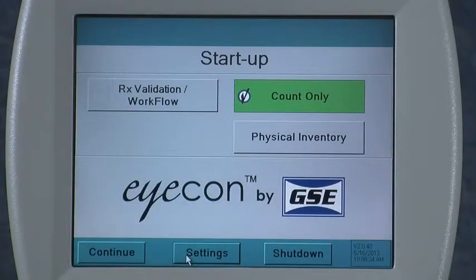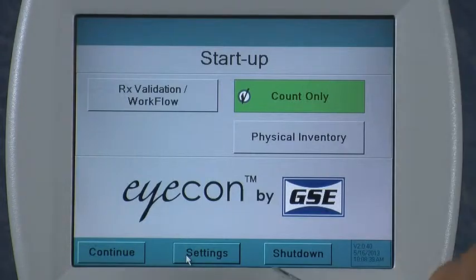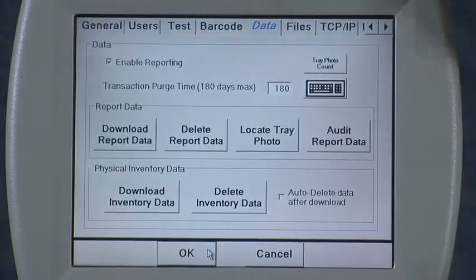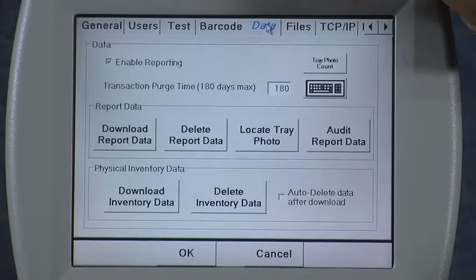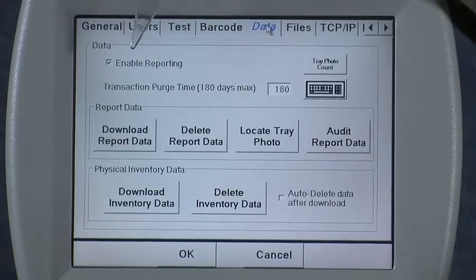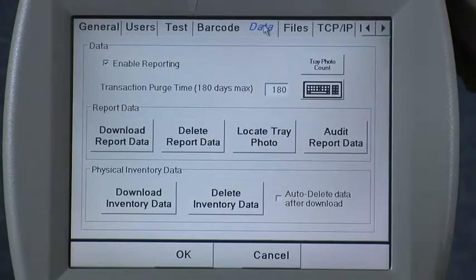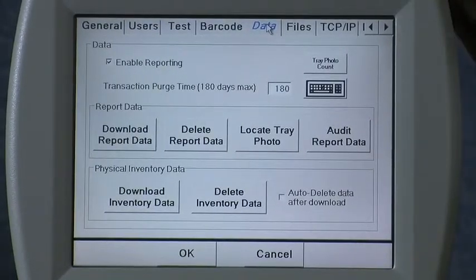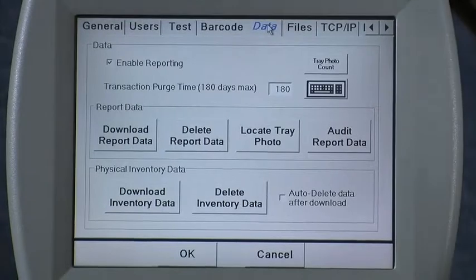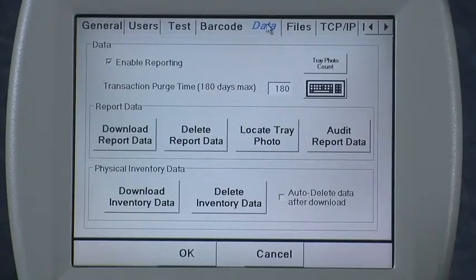Next I'd like to show you how you can access all the data that's collected by the icon. From the startup menu, select the settings button and then the data tab, turning it blue to show you've selected that one. The icon records data every time you fill a prescription, or whenever you count pills in the count-only mode or in the inventory mode. This menu is used for accessing some of that data.